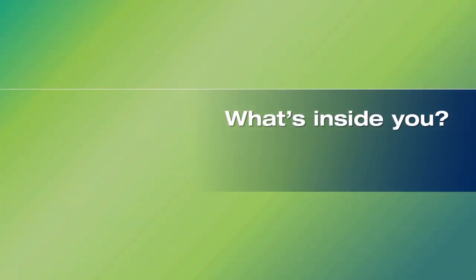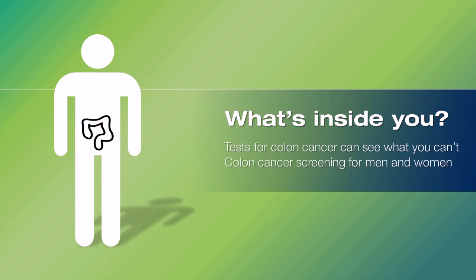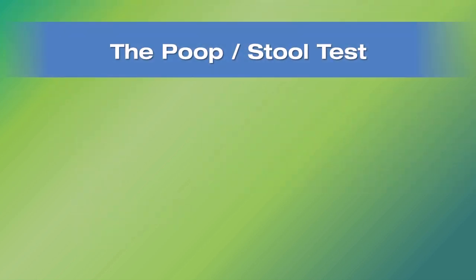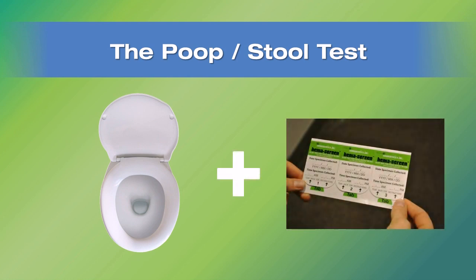Hi, I'm Dr. Megan Davis, and I would like to illustrate how to complete the fecal occult blood or poop test. This test can detect colon cancer early when it is curable. If you are a man or woman over age 50 and under age 74, and if you do not have an immediate family member with colon cancer, then you should get the poop test.